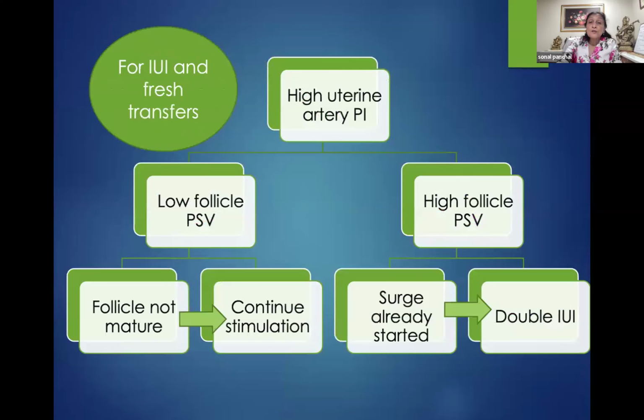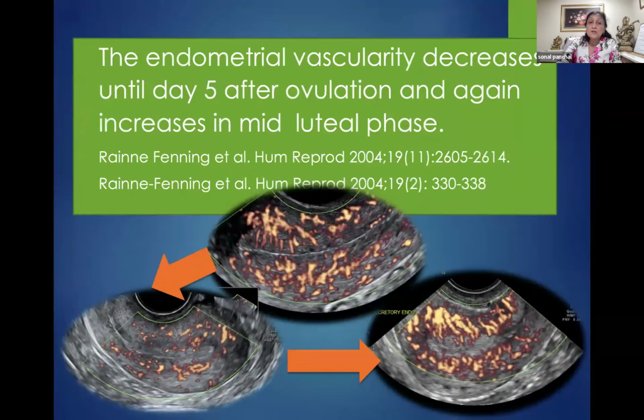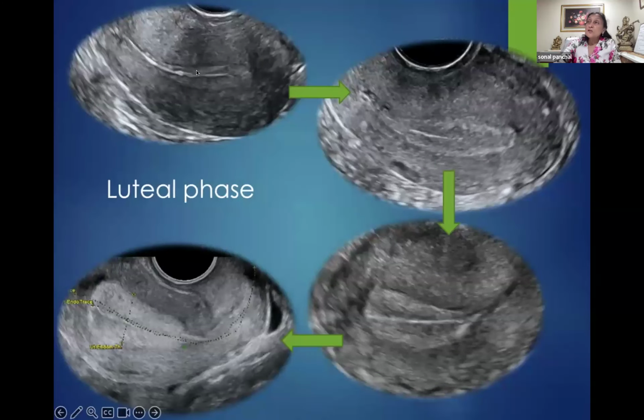And it is also during this time that you would find changes in the endometrial morphology immediately after the start of the surge. Because of the compacting effect of the progesterone, you would find fluffiness of the outer margin of the endometrium instead of sharp, pencil-line-like margins. But beyond 24 hours of progesterone exposure, or beyond the physiological levels of progesterone, you would see hyperechogenicity of the outer margin of the endometrium, which gradually spreads into the inner layers, becoming absolutely hyperechoic and homogeneous only in the mid-luteal phase.